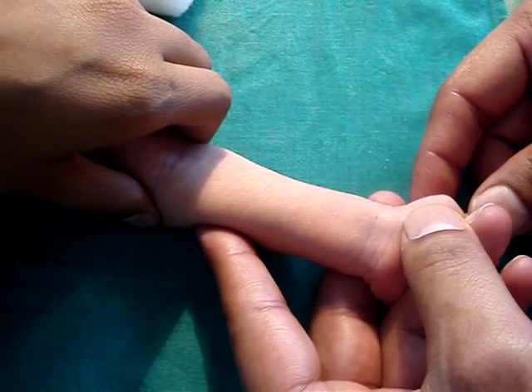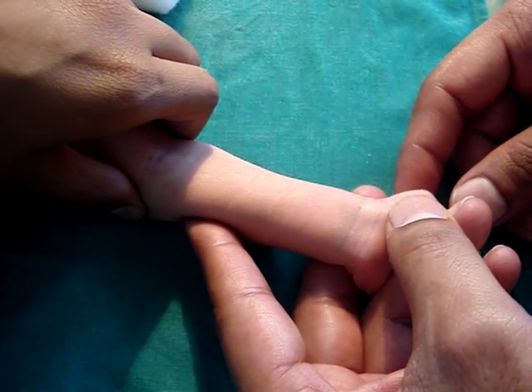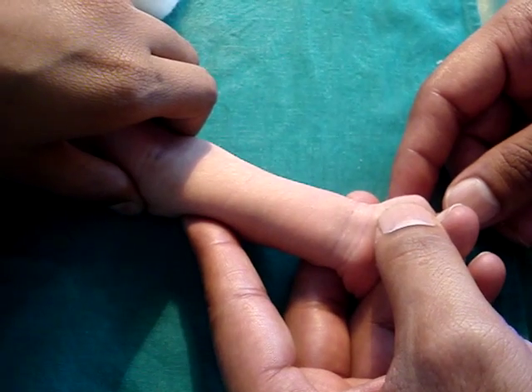Now, I am going to use Dr. Raichur's method of making the radial artery prominent for arterial cannulation or for stab puncture of the radial artery.